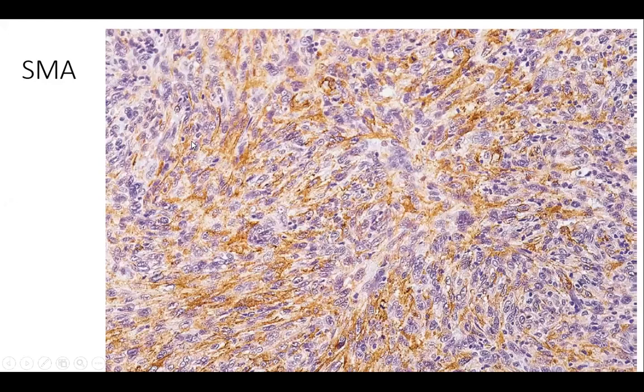The diagnosis would be, like Hassan said, atypical fibroxanthoma. So AFX is a diagnosis of exclusion, usually when everything is negative. You don't need a positive SMA to diagnose it, but it helps.